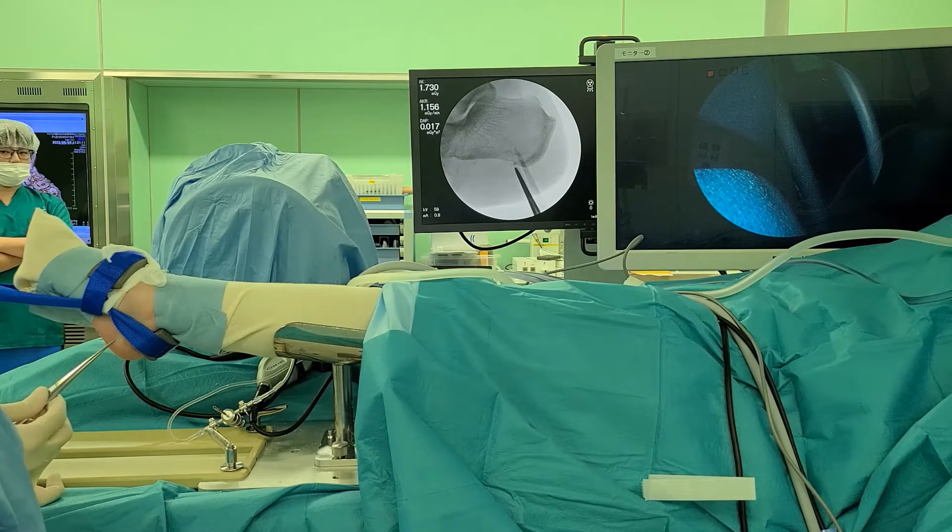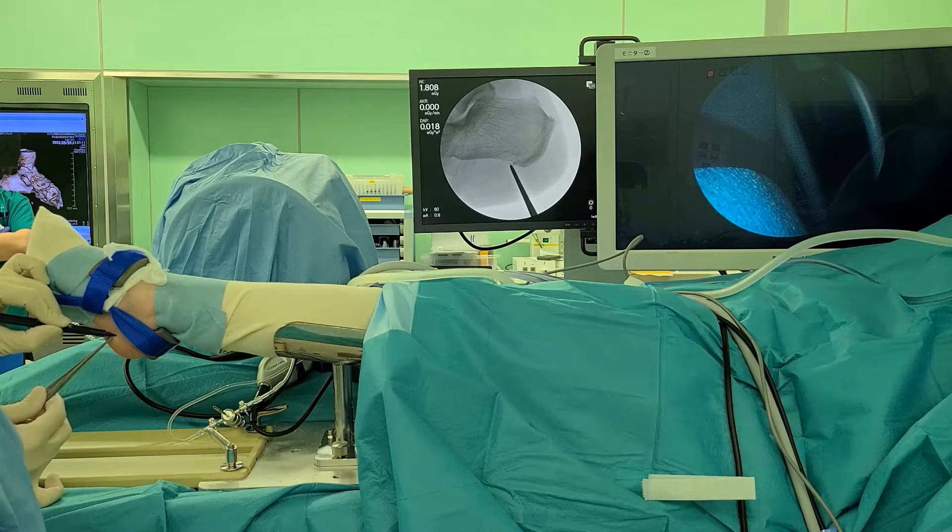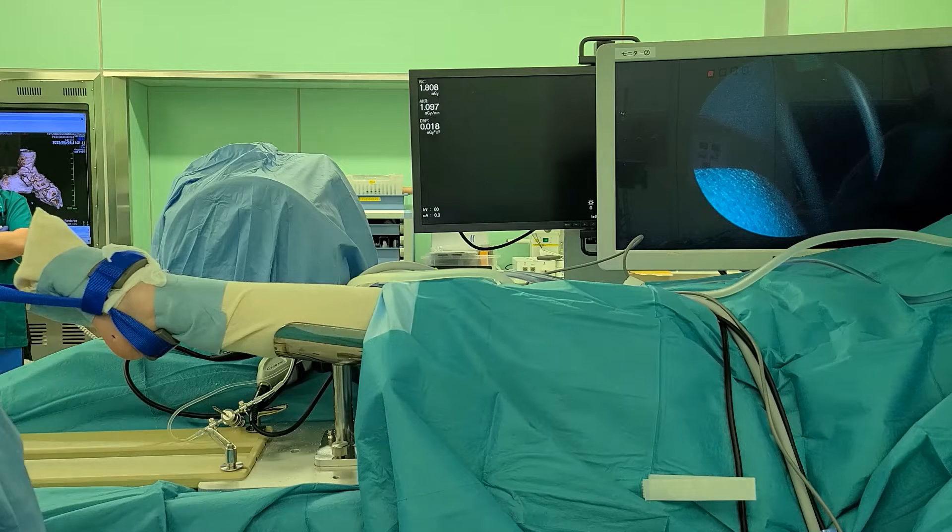The C-arm was placed under the table to obtain a perfect lateral view of the calcaneus. The tip of the calcaneal spur was marked on the medial and lateral sides of the foot using the lateral view during fluoroscopy.